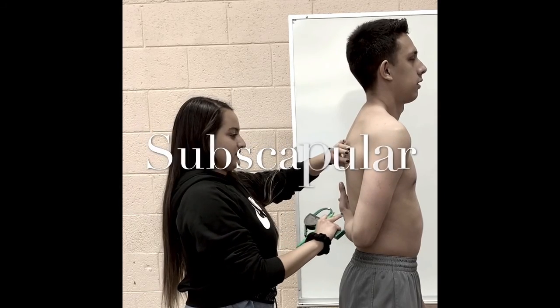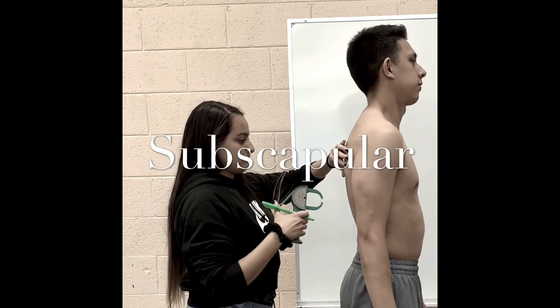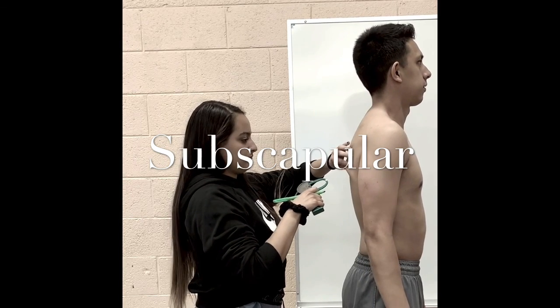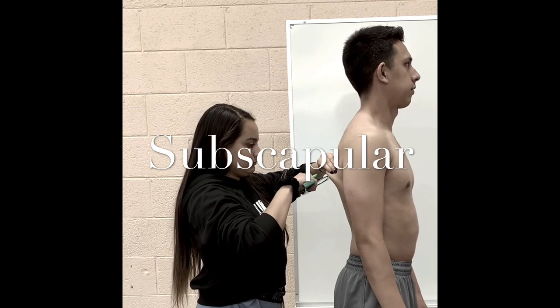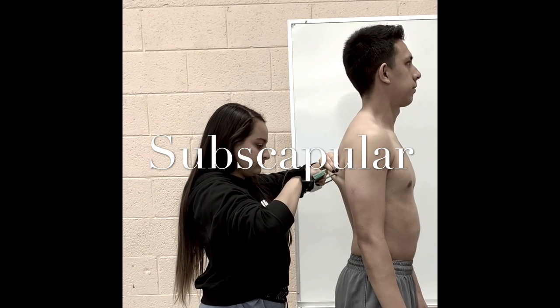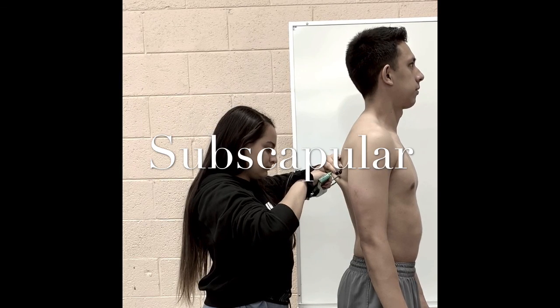For the subscapular site, have your client put his right arm behind his back in order for you to palpate 1 to 2 centimeters below the inferior angle of the scapula. Once you have found it, have your client move his arm back to his side. The fold will be made in a diagonal direction, preferably at a 45-degree angle.